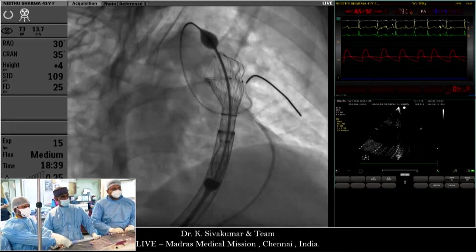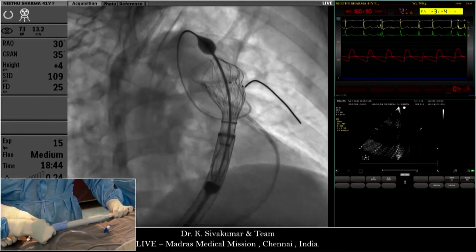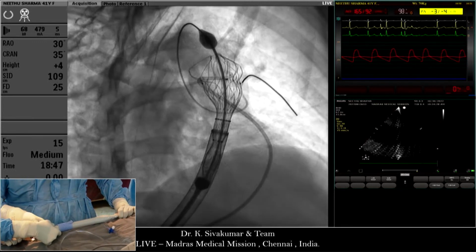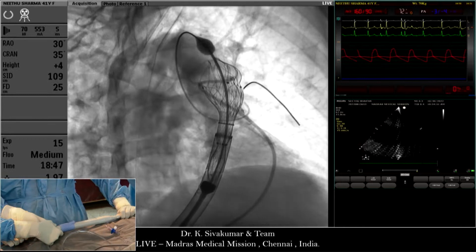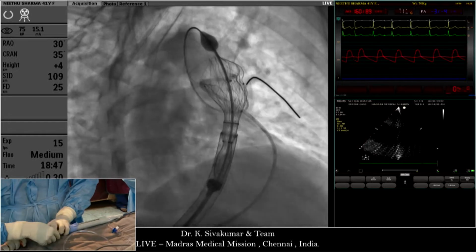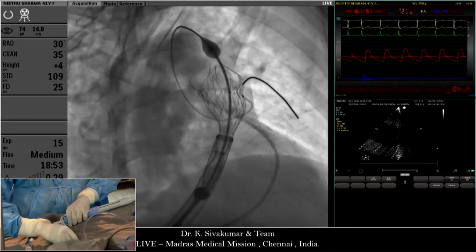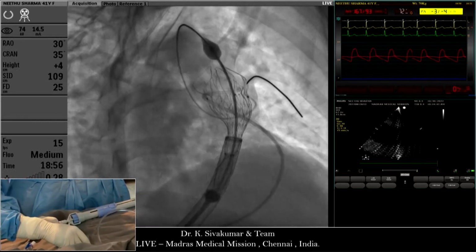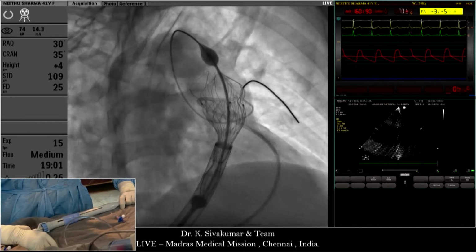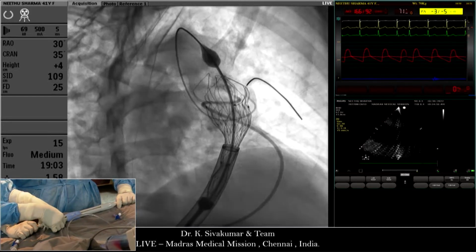We can come up to 2/3 and then stop. Stop here. So, ready for another angiogram? I'm still a little bit inside. So I'll just drop the valve a little bit inside. That's enough, I think. Inject here. Looks better now, I think.